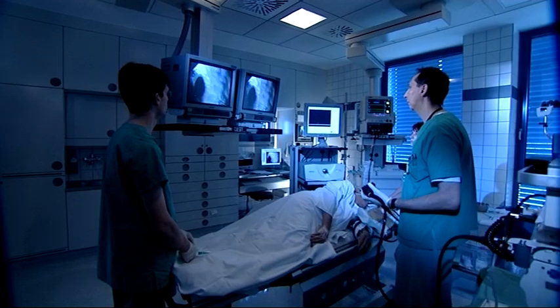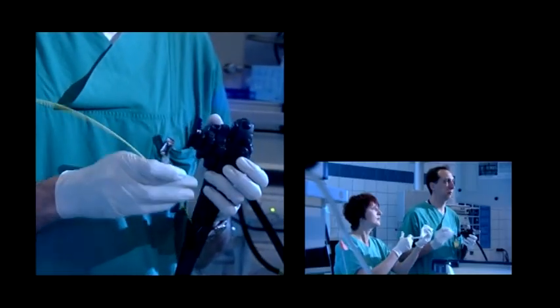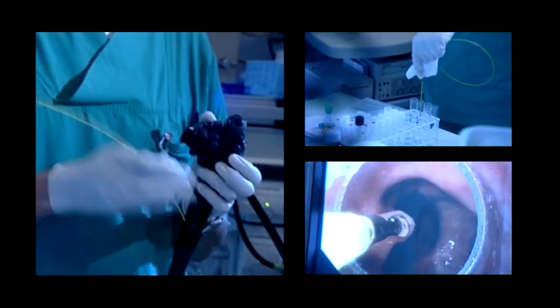It may help orient patient treatment and staging of biliary and pancreatic cancers. In the surveillance of Barrett's esophagus and ulcerative colitis, enhanced endoscopic techniques are not accurate enough to reduce the large number of biopsies required to identify a malignancy.